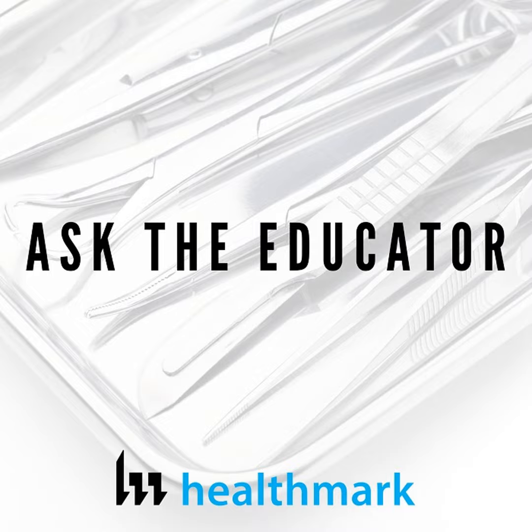When you think about it, there's over 140 different procedures that we annotated. And there's still more because that didn't include ophthalmology, dentistry, periodontistry, and other fields of medicine. We just looked at the hospital proper. So to declare that all of them are non-critical preemptively is a bit hard to intellectually grasp. Second, it's not the name that discerns Spaulding. It's what the transducer touches that discerns Spaulding. And Spaulding correlates, again, to your level of disinfection. So what that transducer touches discerns its disinfection.